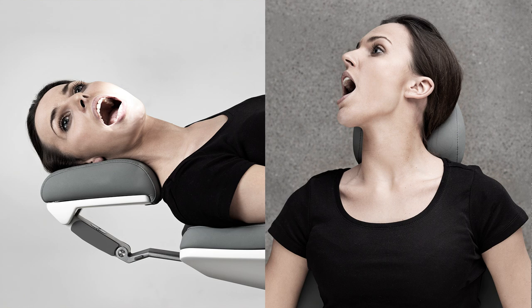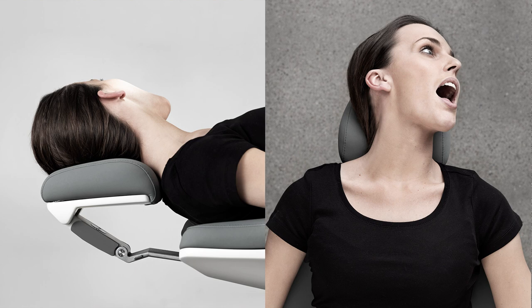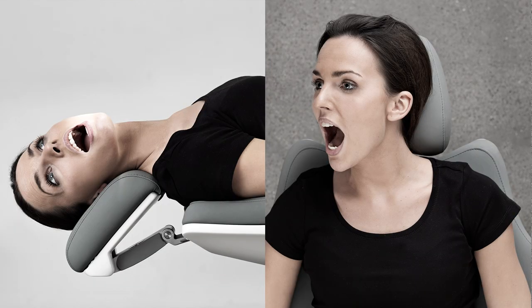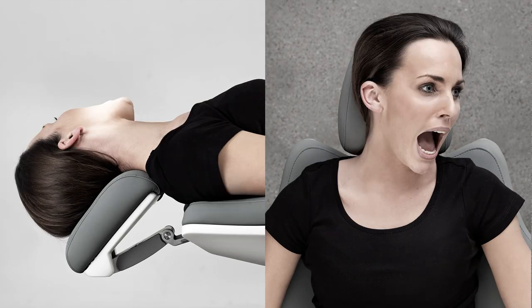The patient chair neck rest allows you to place the patient's head in six different positions. This, combined with the flexibility of working in positions between 9 and 12 o'clock, provides you with the best possible view of each tooth surface without bending or straining your neck, spine, or upper body.